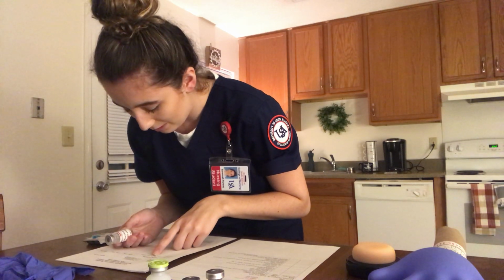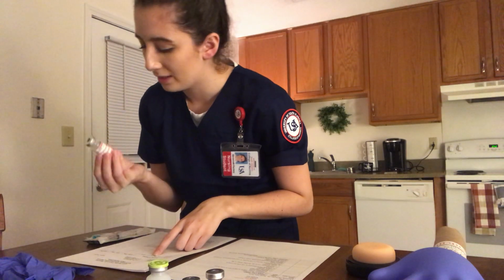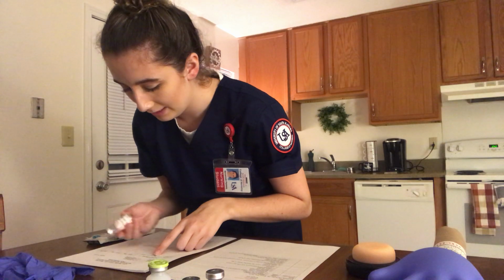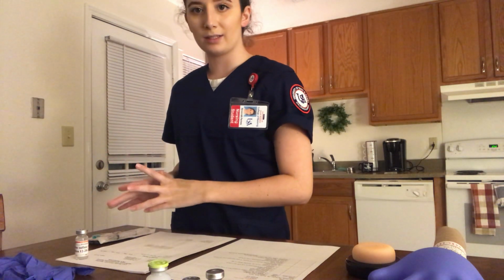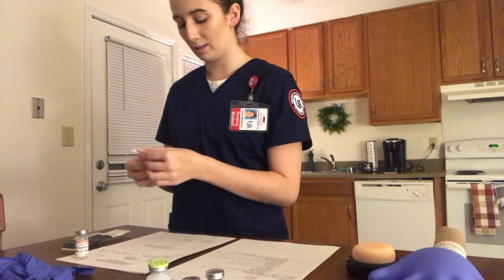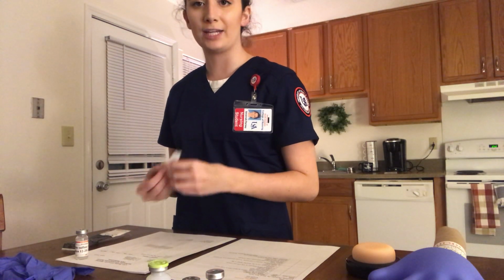And then I will also calculate the correct dosage. It's asking for 5 milligrams to give to the patient. And on here it says it's 10 milligrams a milliliter, which means we would give the patient half of a milliliter. After doing that, we will make sure we have the right supplies. So I have a 3 milliliter syringe, a blunt fill needle, and a 23 gauge 1-inch needle.